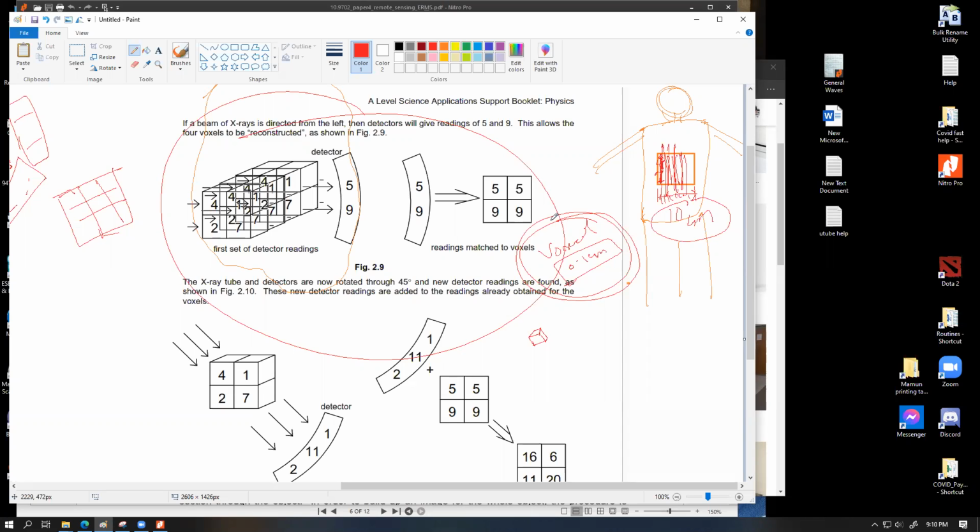So that means these 100 scans, they integrate together to form the final 3D image. Precisely, pretty much like a Rubik's cube, if that's easier to visualize.